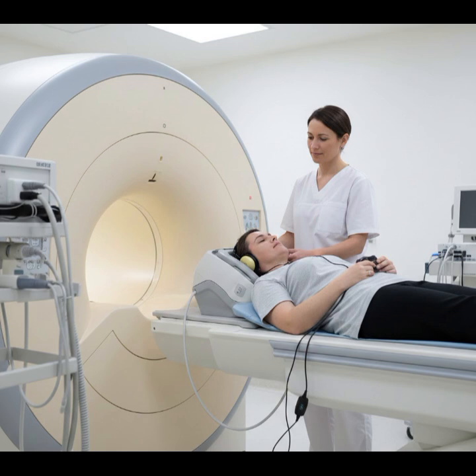Now move to your sagittal planning. On the coronal reference, make sure the central slice aligns parallel to the midline of the brain. Cover the entire width from left to right, centering precisely over the midline on the axial view.